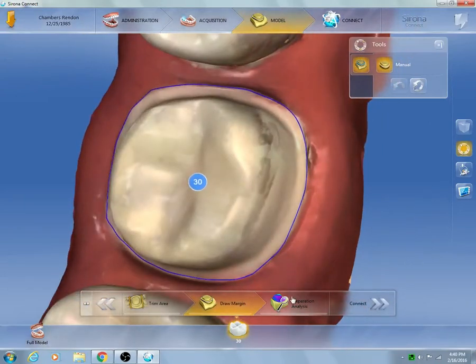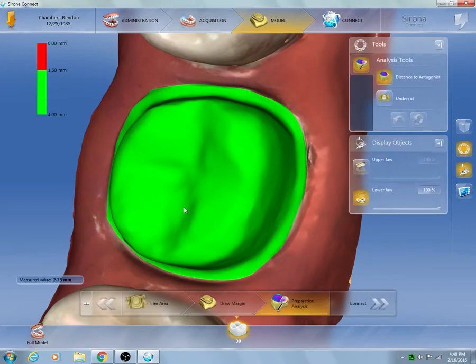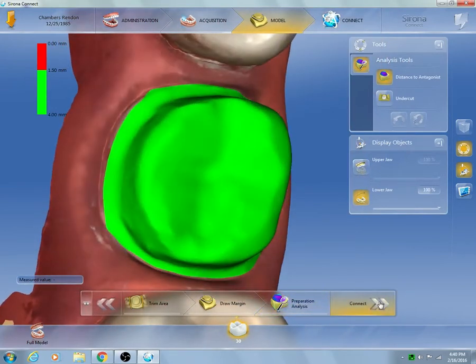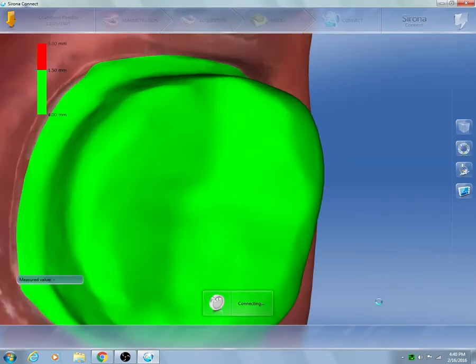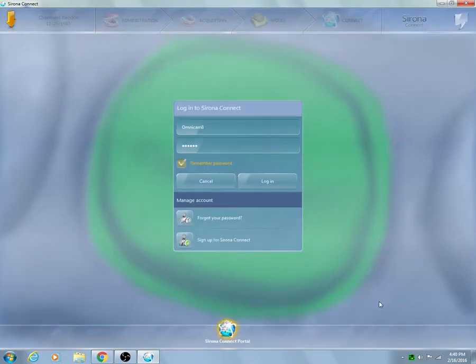At that same point I am able to zoom in and take a look at my interproximal contacts. This is a new additional feature called prep analysis, where you are able to actually see the height and depth of the prep to make sure that you have enough room for the desired restoration and material requests.